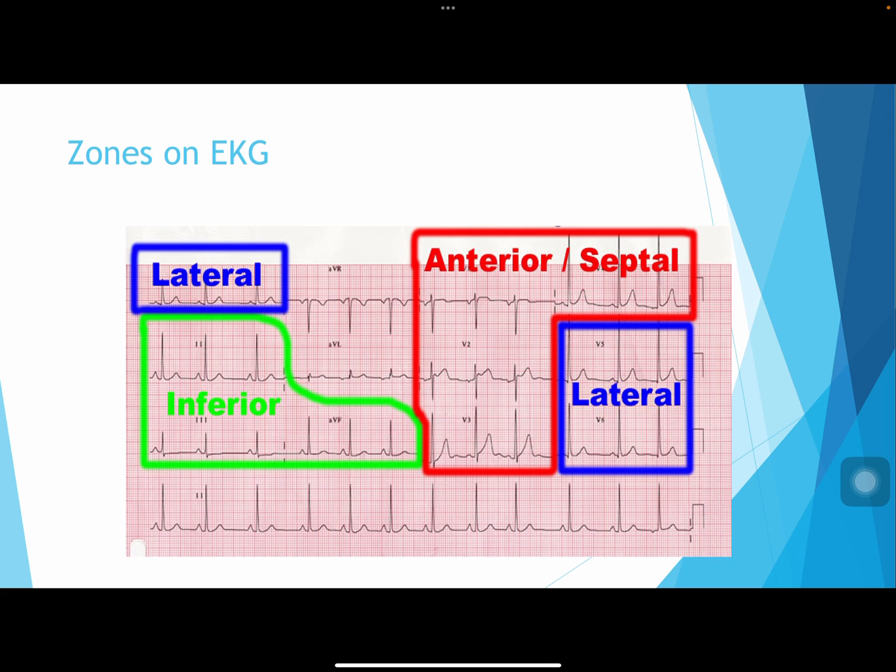If you go to the next slide, this slide is strictly for your reference. It's the EKG zones. I always like seeing things like this because it puts it into perspective. It shows the different leads in relationship to where they are in the heart and what coronary arteries they follow as well. So I put that in there as a reference for you to utilize.